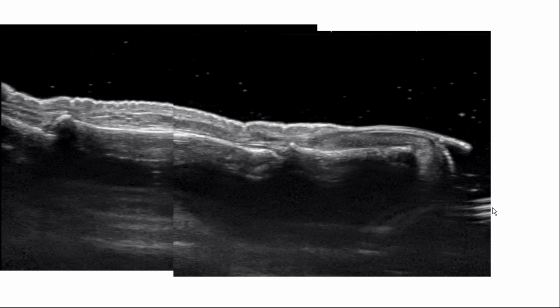And I think all the people that are here have all done module 2A and are familiar with upper extremity imaging. Now that's the dorsal aspect of the digit. So this is the distal phalanx, this is the middle phalanx, and that's the proximal phalanx. Can you see the extensor tendon? Yes. So this is much harder to see, no matter how much gel you put. Sometimes it just gets so messy, and when you're imaging, you don't see it very well, and sometimes you just have to rely on dynamic assessment.